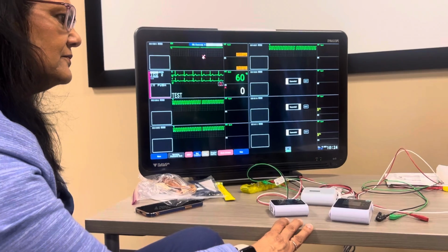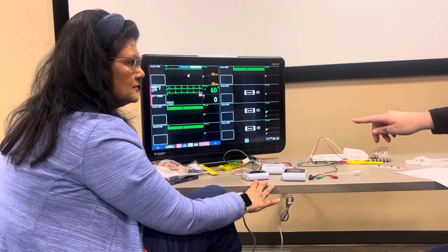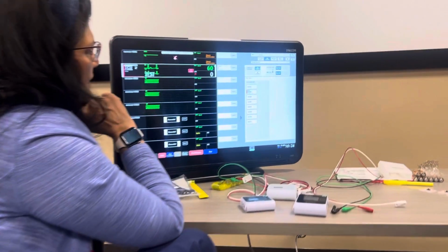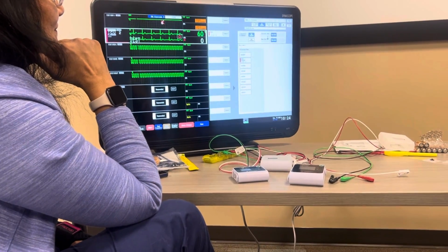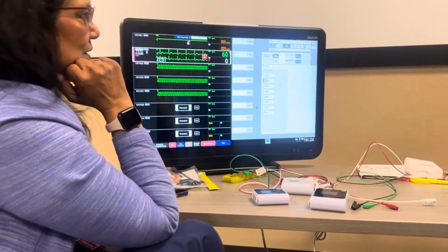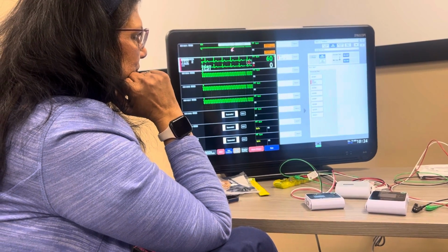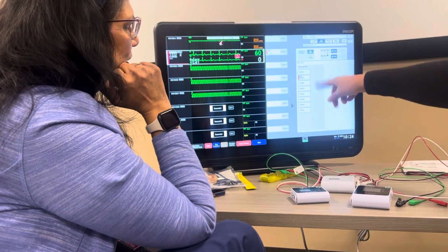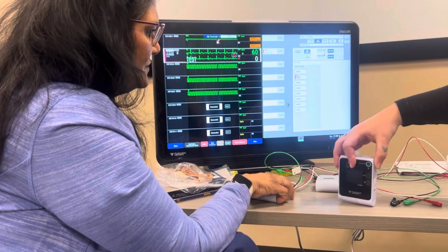Wouldn't you just click on the ECG, or you can do bed transfer? So you want to do bed transfer? Yeah. There is no shortcut though if you just click on the ECG. Now what do I do? We're in the transfer exchange. Are we in the right place? Yep, you are. We have the new numbers, so if we were going from 1001, we would go to 1011.